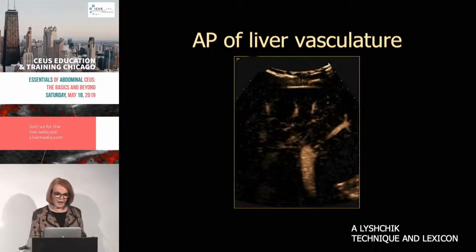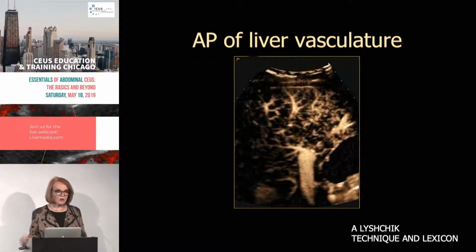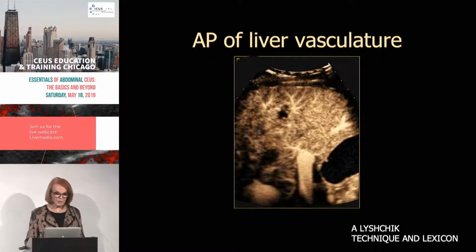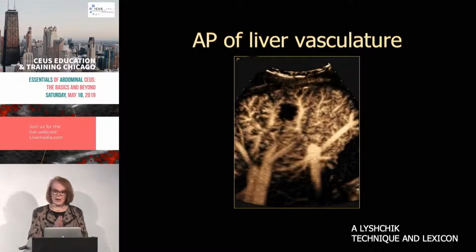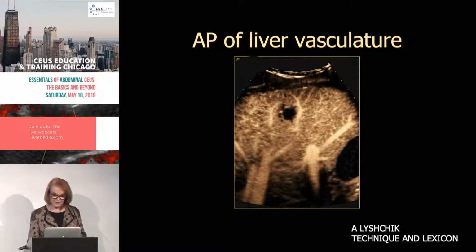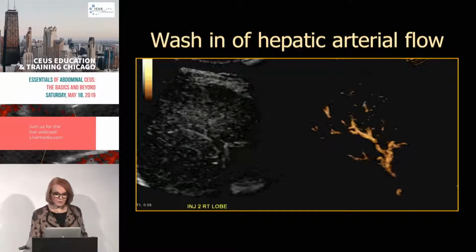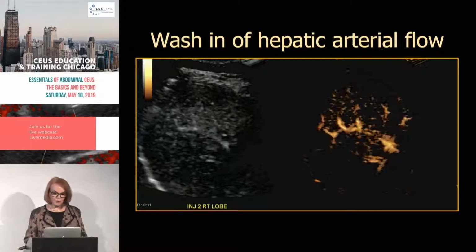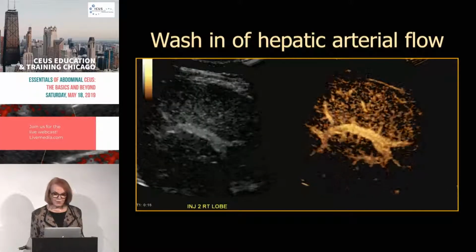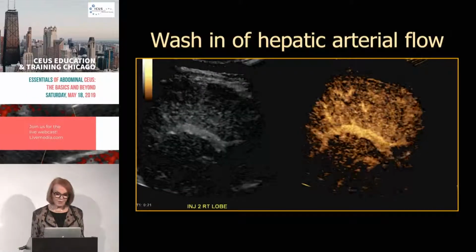Here, this is just a clip that I made a long time ago, but you can see that when we're watching the microbubbles come in, we see the artery and we see the portal vein fill, and you can see how beautifully we can actually record the enhancement of the vessels, and that we can see, in fact, the timing of what's going on in the liver. Right here, this is just a regular patient. If we line up pointing at the porta hepatis, you can see how beautifully we can see first the hepatic artery enhanced and then the portal vein.